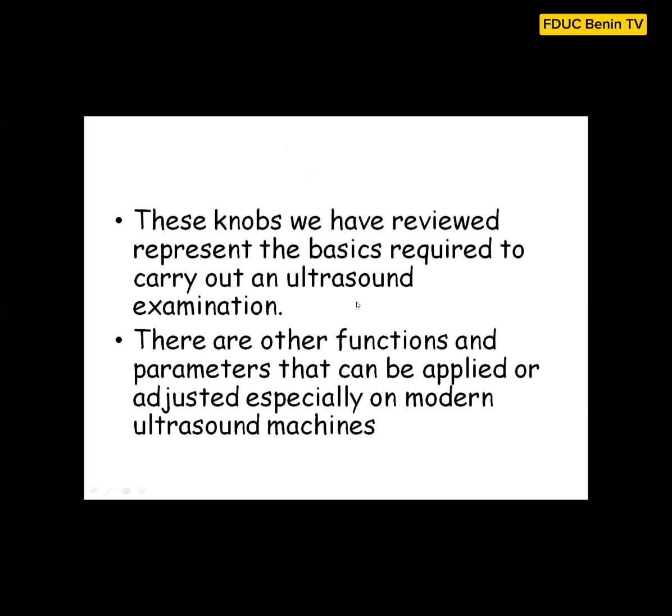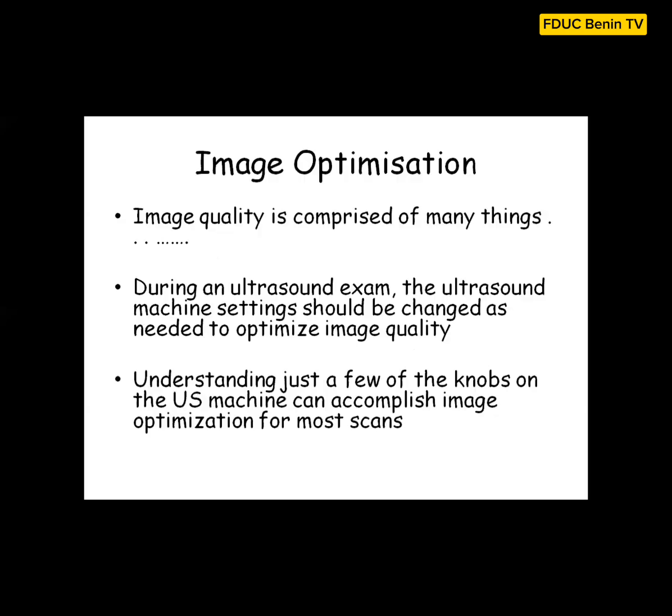So the knobs we have reviewed represent the basics that we are required to carry out an ultrasound examination. There are other functions and parameters that can be applied, especially when we are using a modern ultrasound machine. But the whole aim of the study of knobology is to ensure that our image is of high quality and that we understand the knobs and use them to achieve optimization of our image.